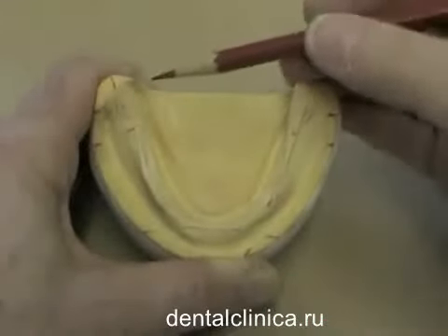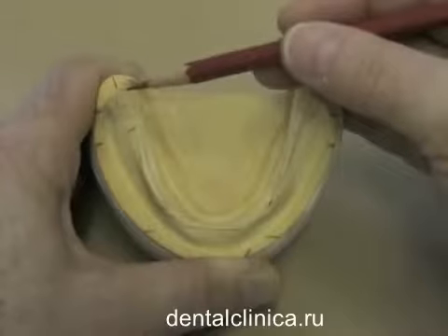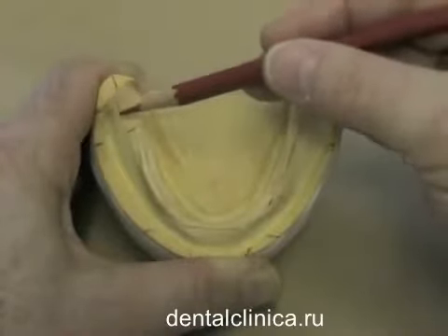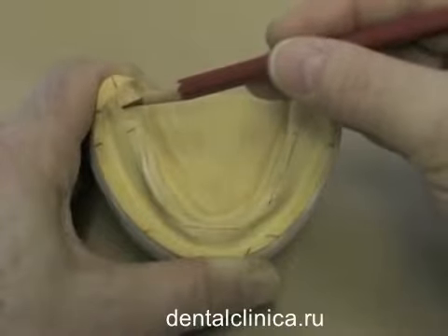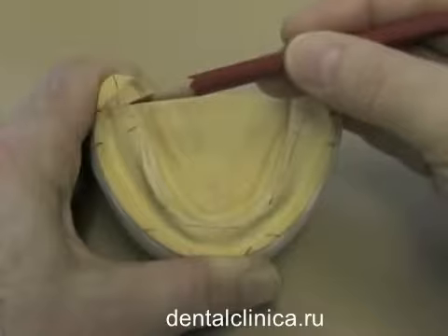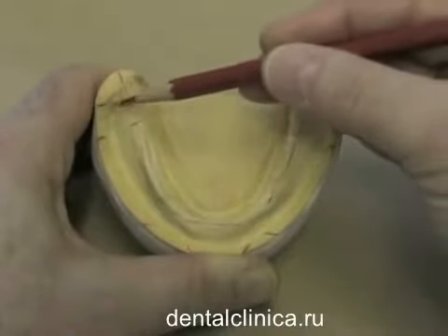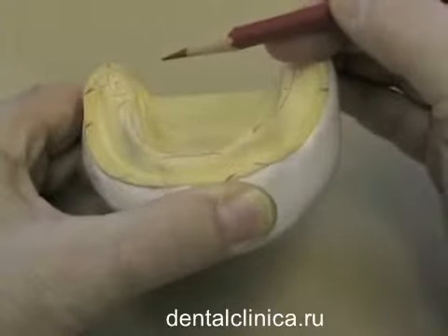Before you begin to set your denture teeth, you should make a couple of reference lines on your cast. Firstly, you should outline the retromolar pad. And on that circle of the retromolar pad, you should put a point midway along the retromolar pad and bring that line outwards. Put it on your land area.